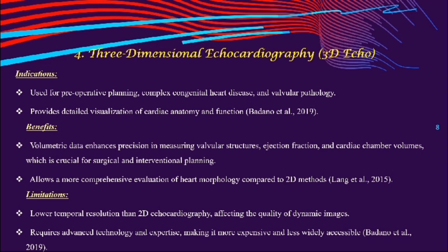Limitations: lower temporal resolution than 2D echocardiography, affecting the quality of dynamic images. Requires advanced technology and expertise, making it more expensive and less widely accessible.